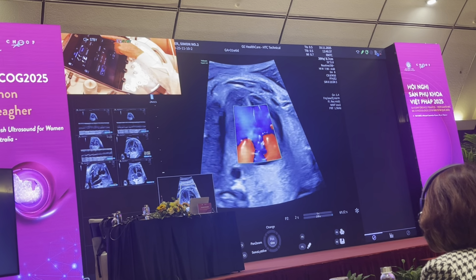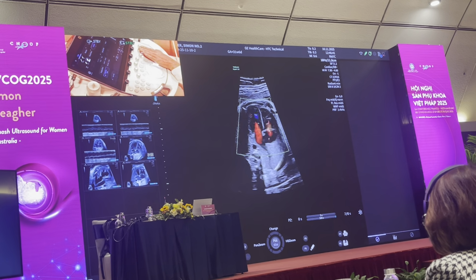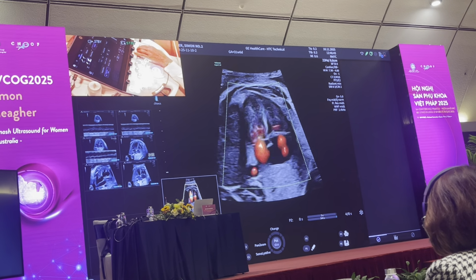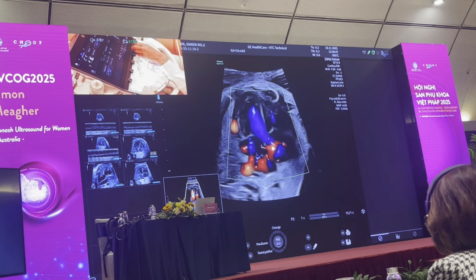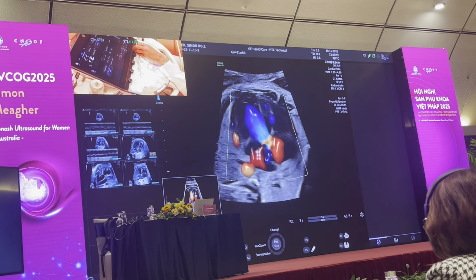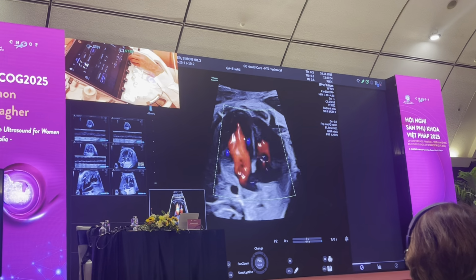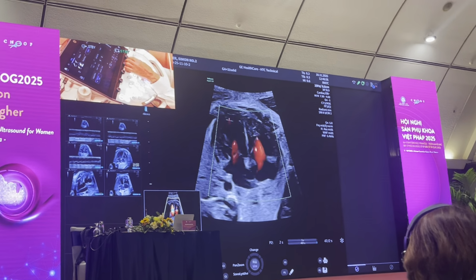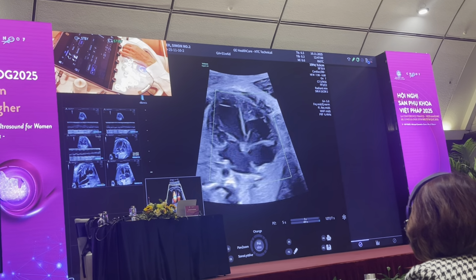So first of all, I've now changed to a cardiac preset. So I now go to a 4-chamber view of the heart, magnify the image. And I'm looking at my PRF, which is at 37. The baby is 31 weeks gestation, this is too low. So I put my PRF up to 68, and now I've got a correct setting. I'm going to increase my dynamic range, and then I'm going to magnify my image.